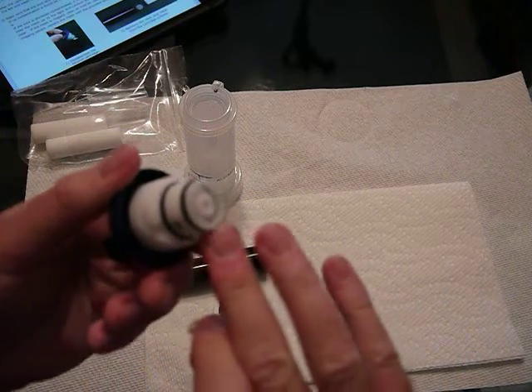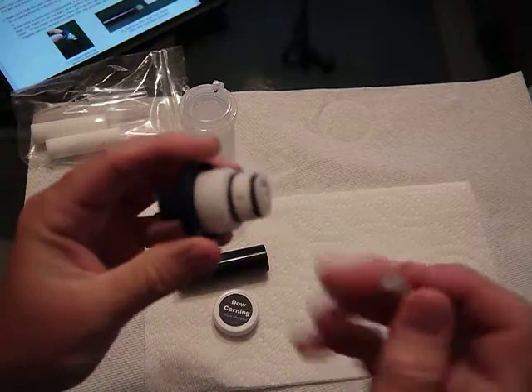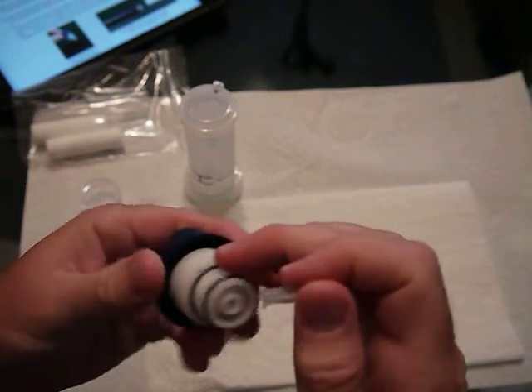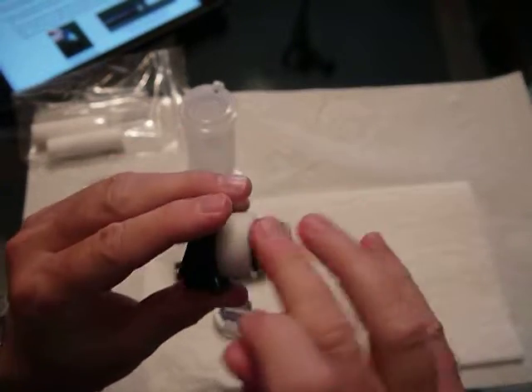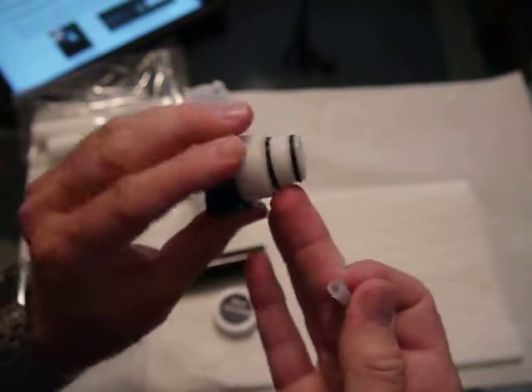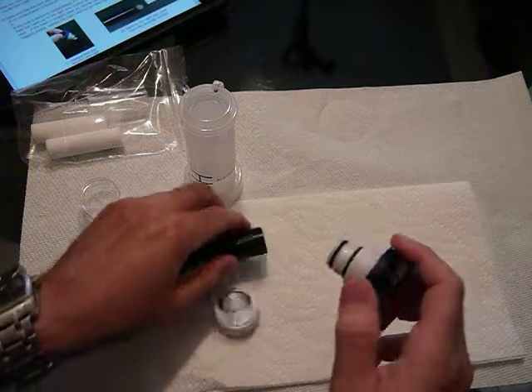Especially when these O-rings are used and are in direct contact with the alcohol, they could dry over time. So I'm going to put some also on the larger O-ring. Spread that around. Again, we don't want huge amounts of it. We just want a light coating.